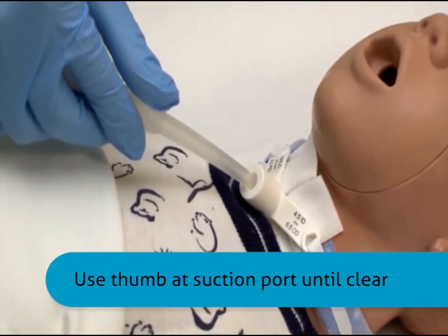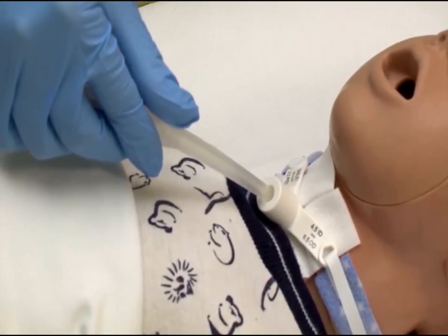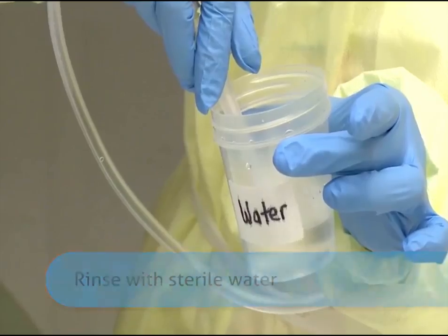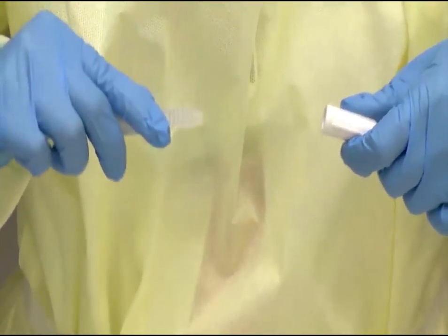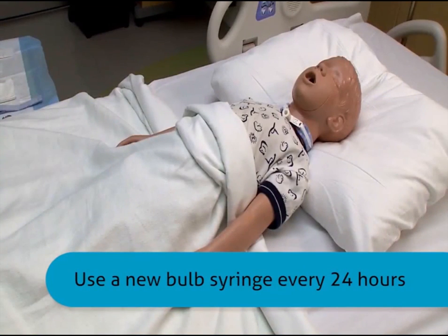Do not suction longer than three to five seconds without permitting the patient to rest. Rinse the neosucker with sterile water. Store in a clean, dry container at the bedside. Obtain a new plastic bulb syringe every 24 hours or as needed.